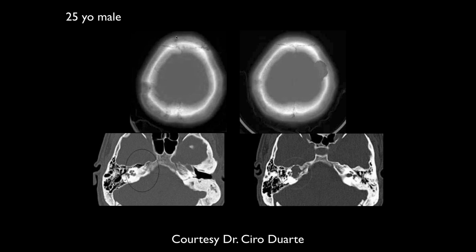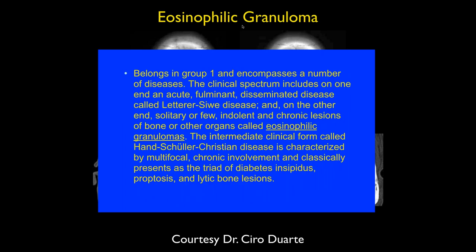Are you talking about these things here? Yeah, what are those? Well, that's probably just fat in the subcutaneous tissues there. Okay. Yeah, I guess you're right. Here the suture is coming across. All right. But I think I would still get a skeletal series on this patient. Good. Yep.